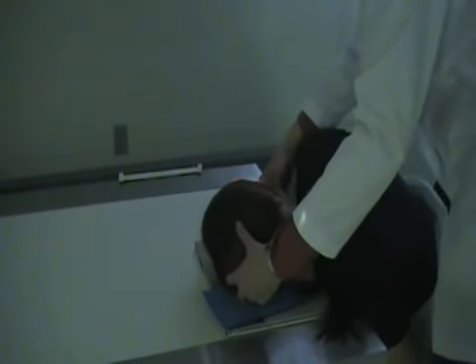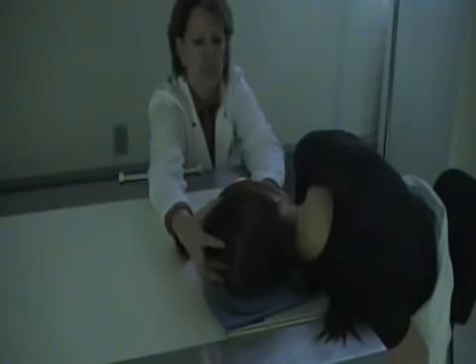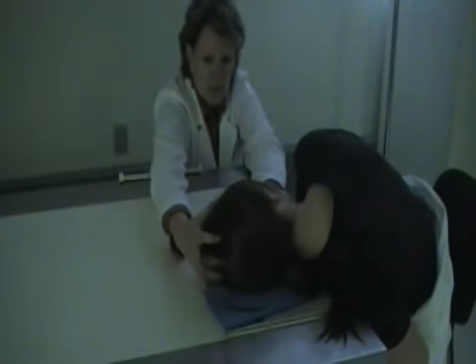Okay, position the head in a lateral position and double check. Make sure that you do have your mid-sagittal line going horizontal and the interpupillary line going perpendicular. Then again, you can center right over that 1/2 inch below the nasion, and then collimate down so that you get the entire nose area. Now, because the left side of her face is down, we're going to put our left marker there.